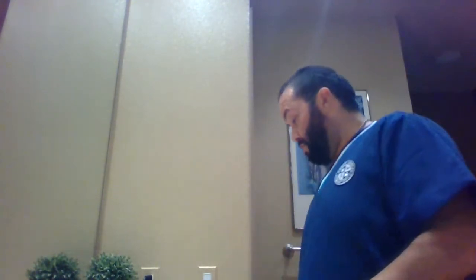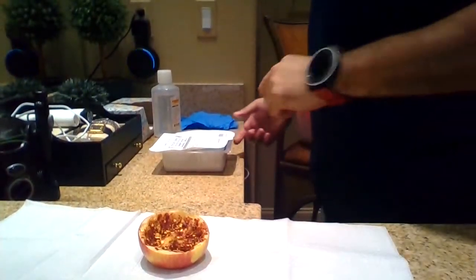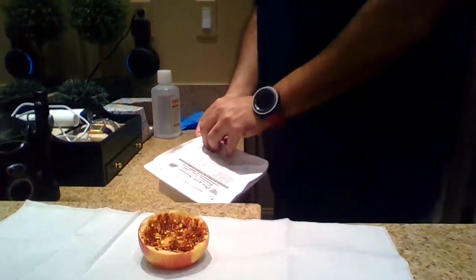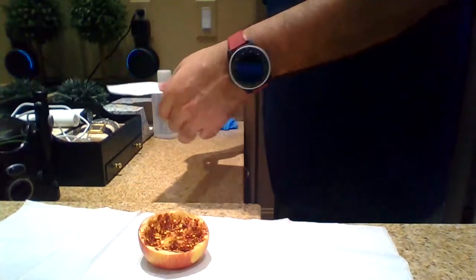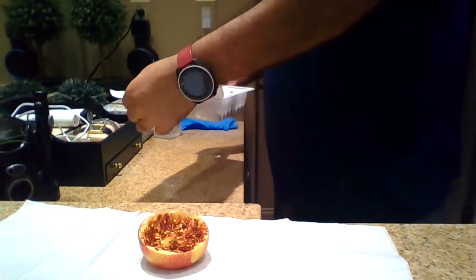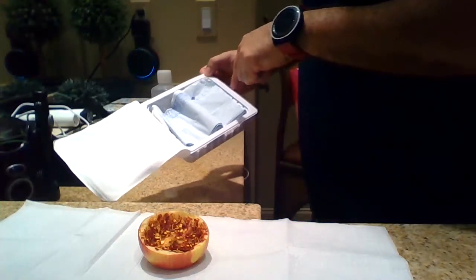So we're going to wash our hands again per CDC guidelines. We're going to prep the sterile field. So in order to do that, when we open this, you will actually see how it says sterile field there.